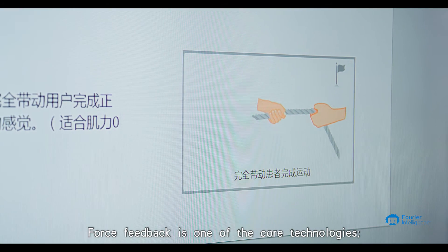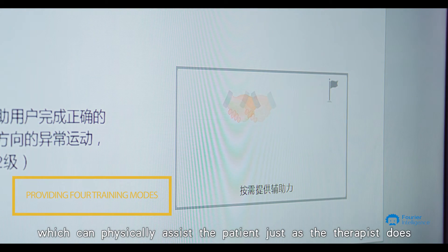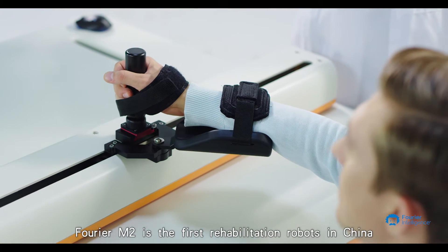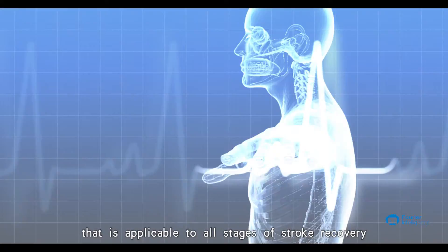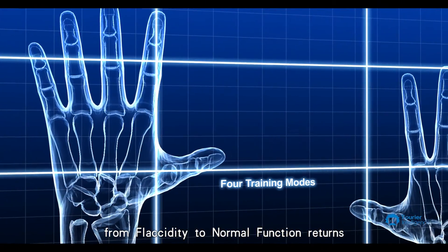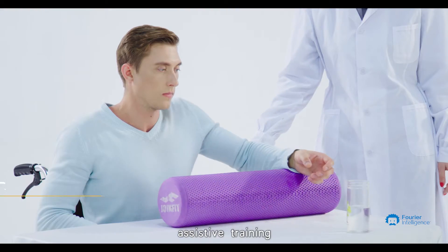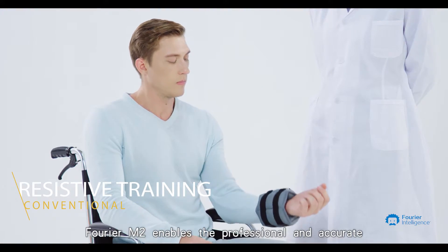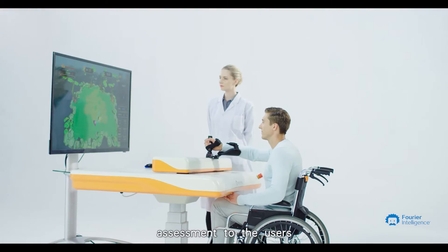Force feedback is one of the core technologies — it provides the robot with the sense of touch, which can physically assist the patient just as a therapist does. Fourier M2 is the first rehabilitation robot in China applicable to all stages of stroke recovery, from flaccidity to normal function return. Whether it is passive training, assistive training, active training, or resistive training, Fourier M2 enables professional and accurate assessment.